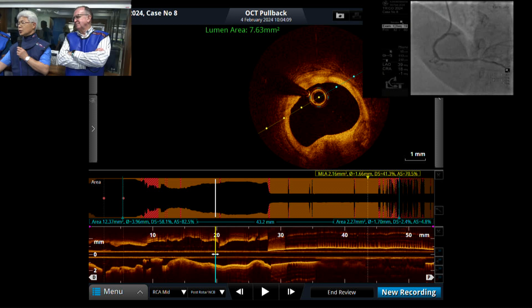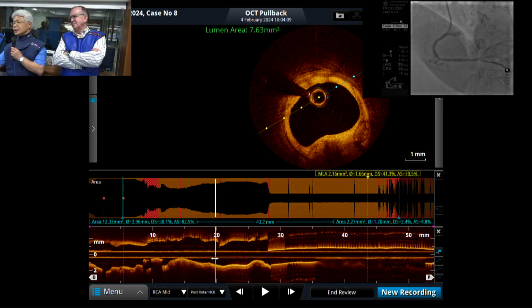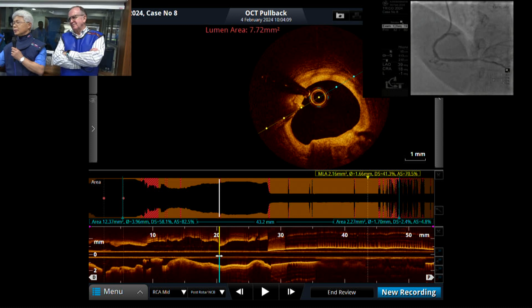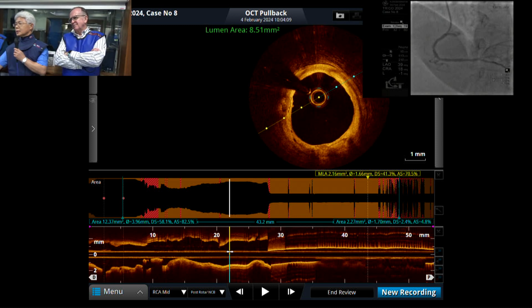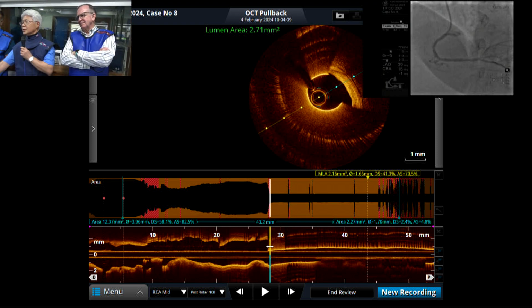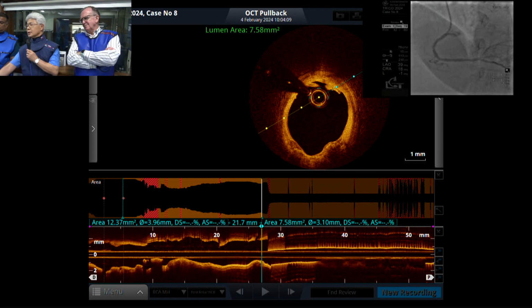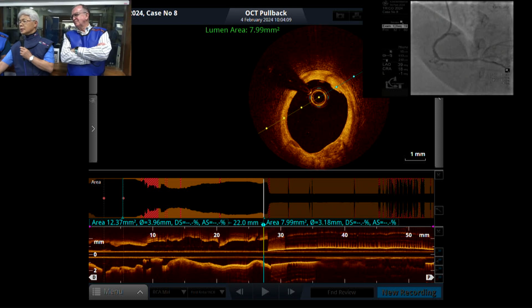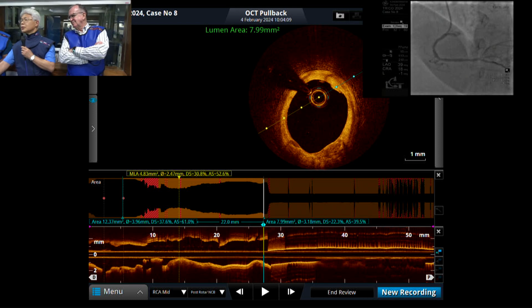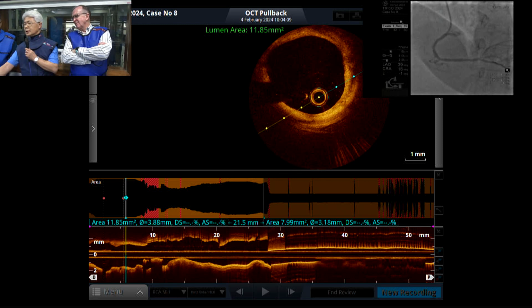So, as I told you, this nodule is far from the wire. That is the reason why we cannot abrade any more. Okay, it's good. Proximal diameter should be around 3.2, I think. Lumen diameter, right? And the distal one is much bigger.